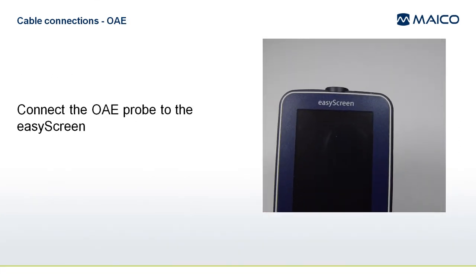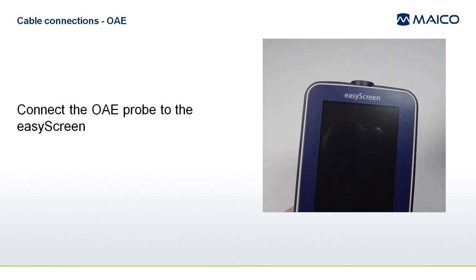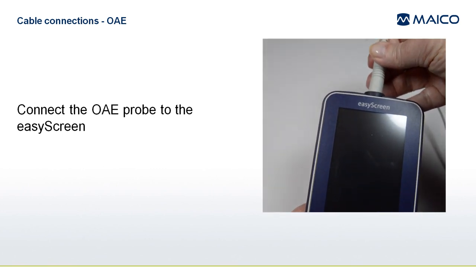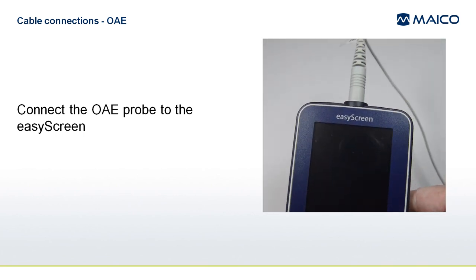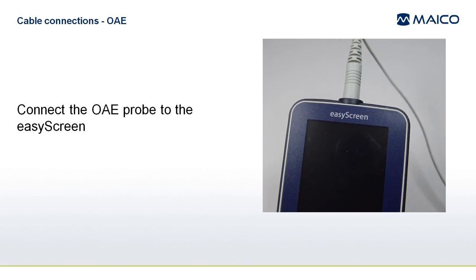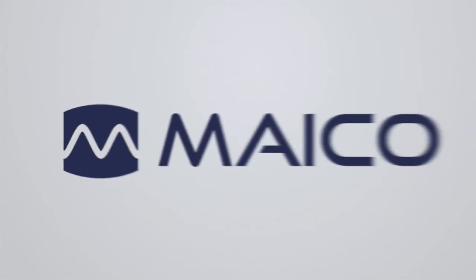To assemble the EasyScreen for performing OAE testing, connect the probe connector into the socket at the top of the EasyScreen. Now you are ready to attach the appropriately sized ear tip to the probe for performing an OAE screening. See the appropriate quick guide for more information about performing the OAE screening.